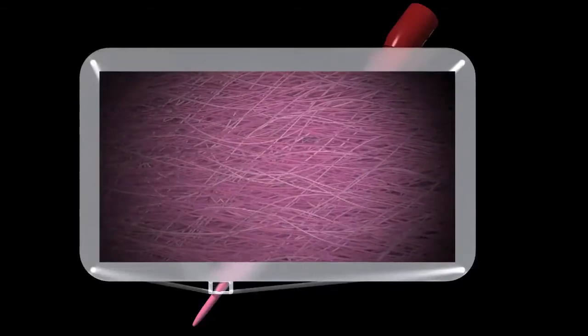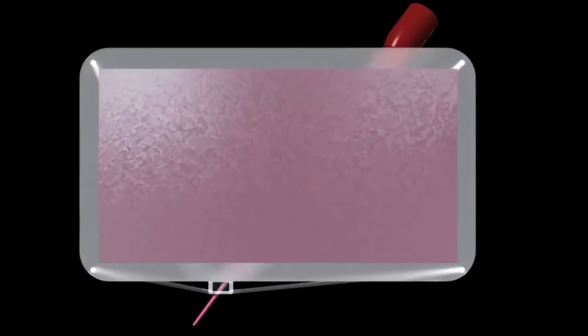As the camera zooms in, we see the difference. A pink core made of cross-linked gutta-percha.